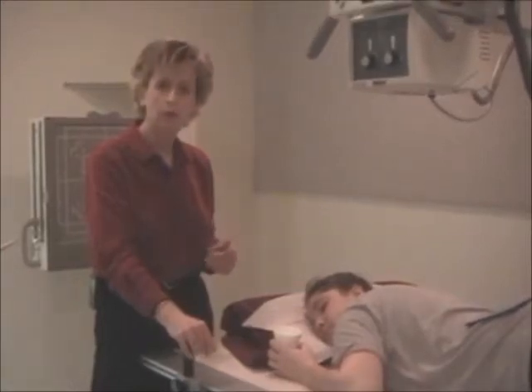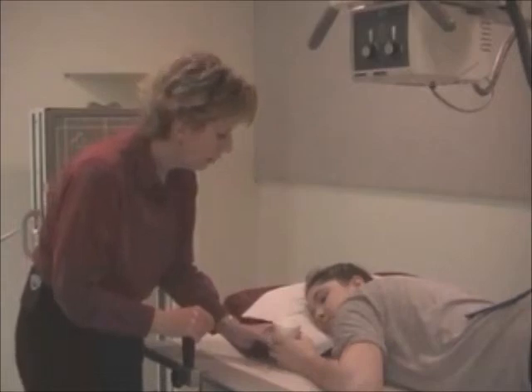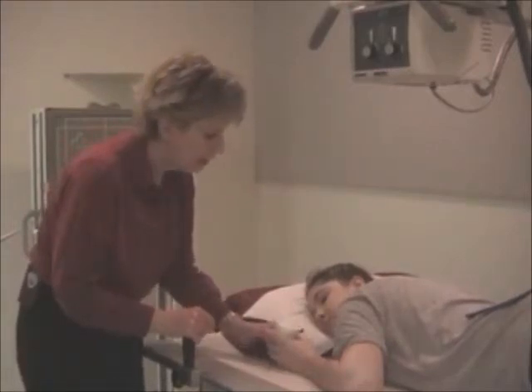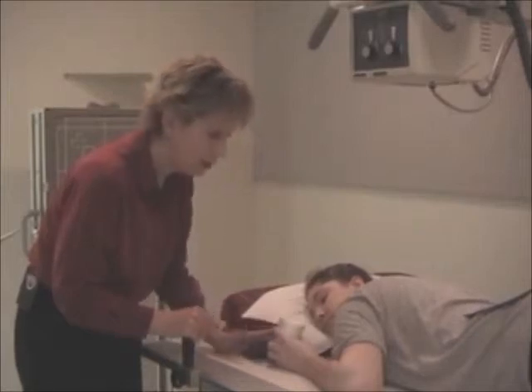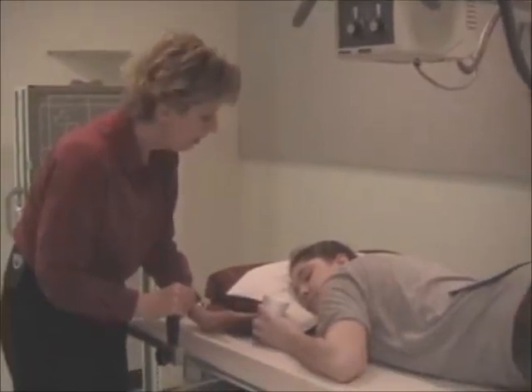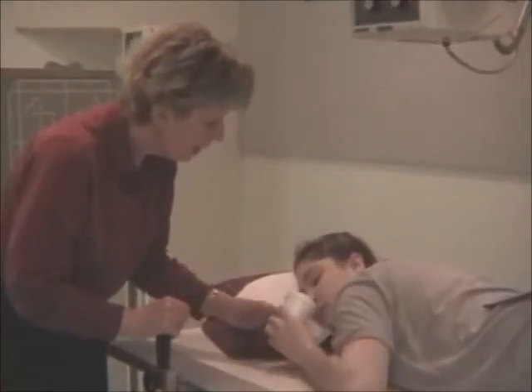Again, your option would be to do it in a vertical mode. Again, we talked about cooperation with the patient, and they have a cup of barium. There's a straw, and again, you've explained to the patient what your job is, and I'm going to have you taking a big mouthfuls and watch them.